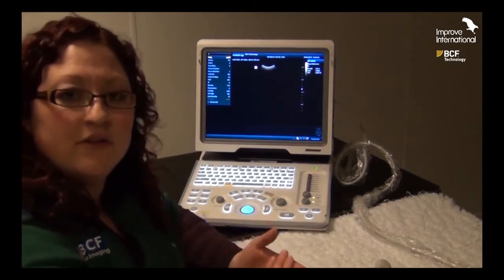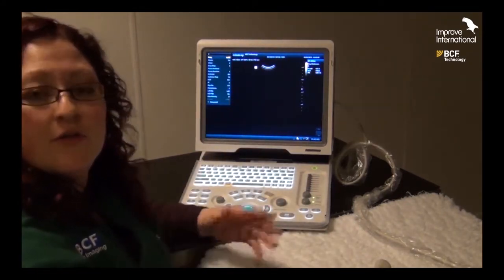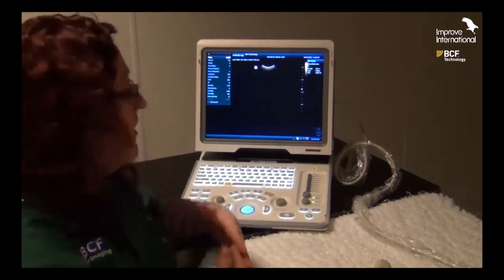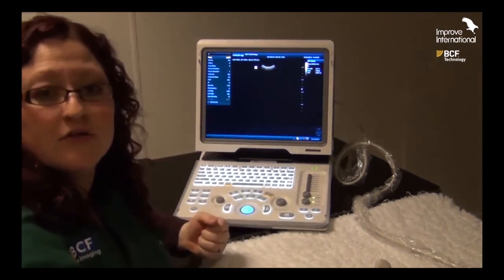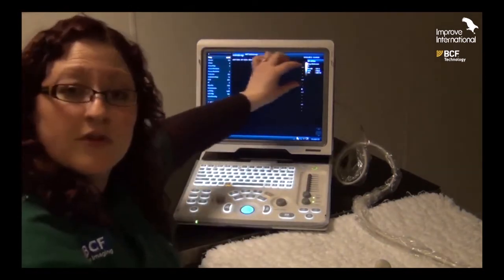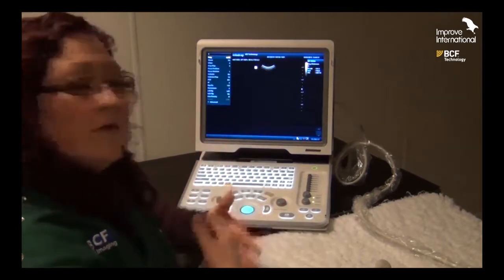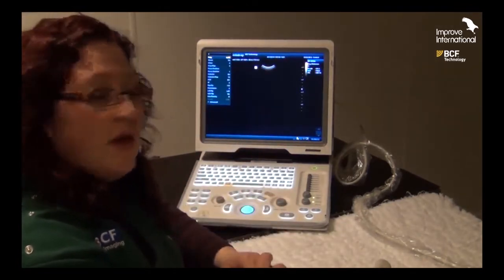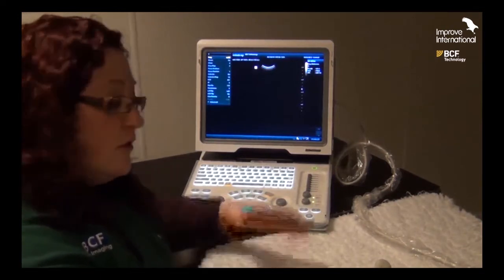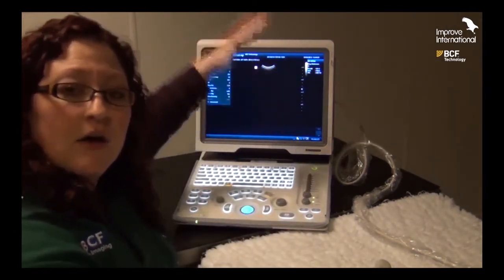There are five main buttons we need to know where they are and what they do to improve the quality of our ultrasound image. The first is frequency. The frequency button helps us achieve a balance between the resolution of the image — basically how clear the picture is — and how deep the wave is able to penetrate. If we're looking at something very superficial, such as a kidney, a loop of gut, or the urinary bladder, we will want a higher frequency setting. However, if we're looking at the liver, which is deeper within the abdominal cavity, we'll want a lower frequency setting. There's always a trade-off between clarity and penetration depth.